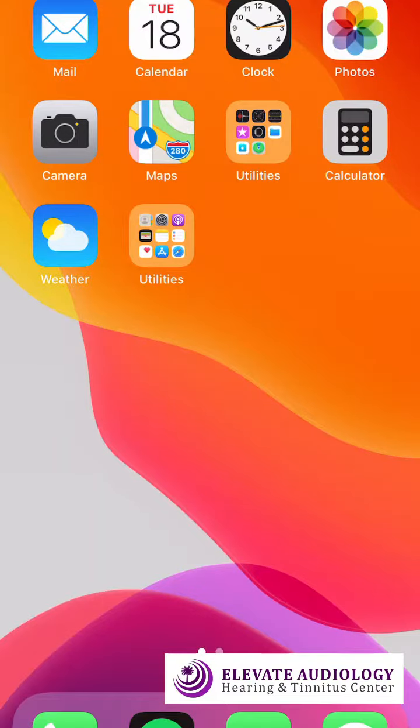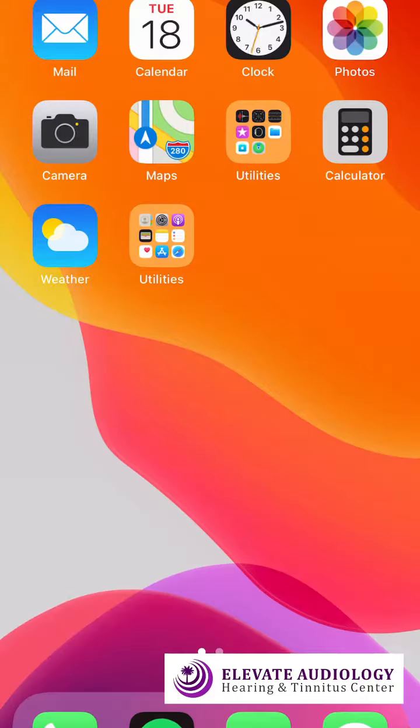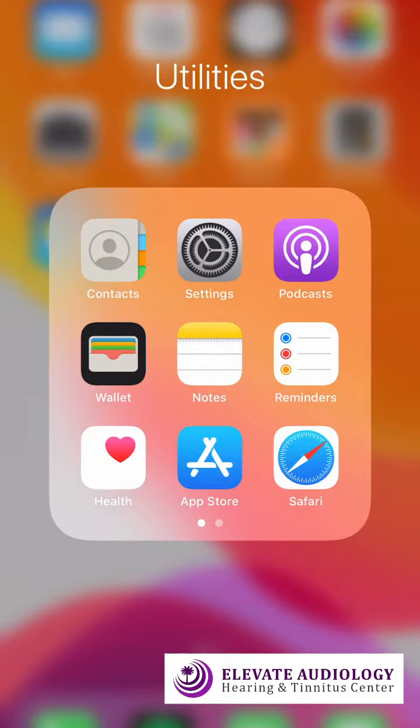To pair your Oticon hearing aids to your iPhone. So the first thing you want to do is make sure that your hearing aids are turned on. And then you're going to want to open your settings app.